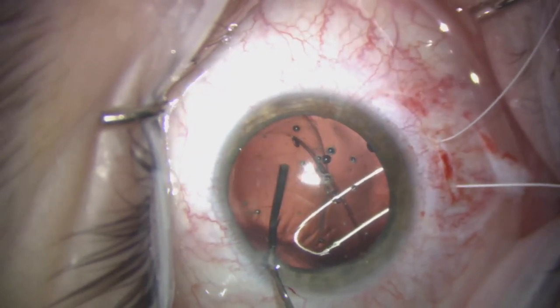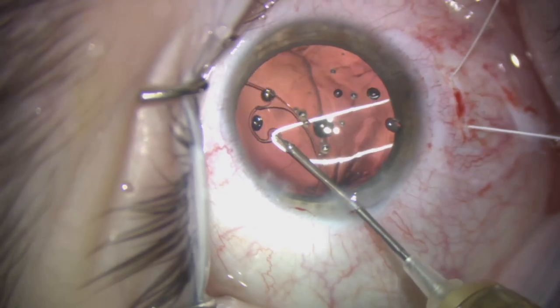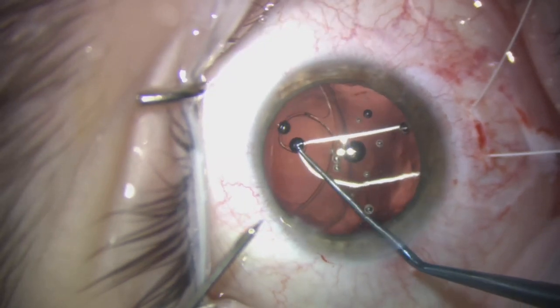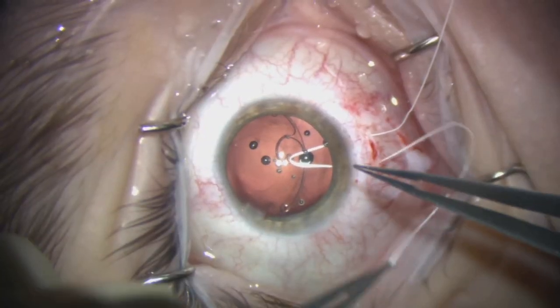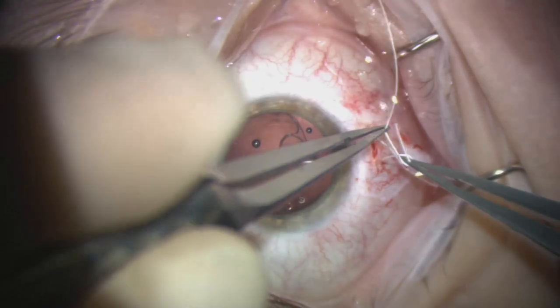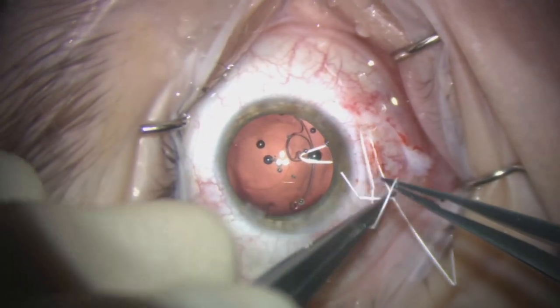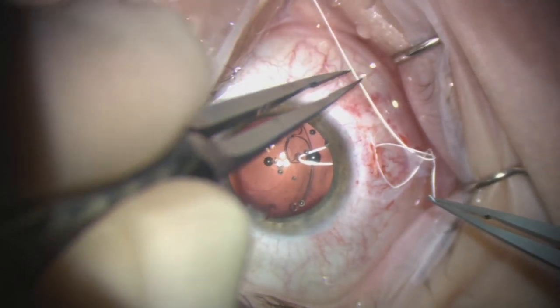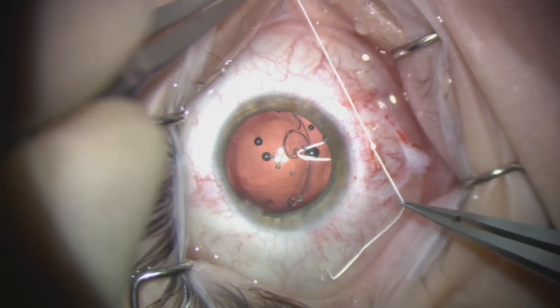The next step is to expand the capsular bag and place the segment carefully inside it. Using a dialing hook as well as micro graspers is very helpful, and this must be done gently so as not to create more zonular trauma. We then gradually increase tension on the segment to try to centralize this very dislocated capsular bag, using a slip knot to gradually increase the tension and working the second knot of the slip knot to get the bag more central in the visual axis.